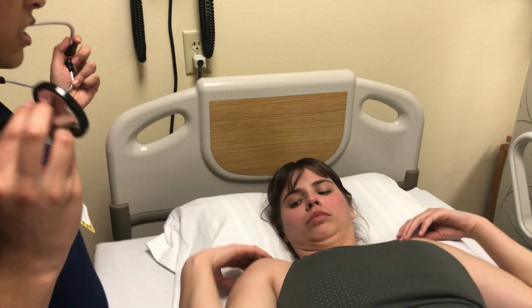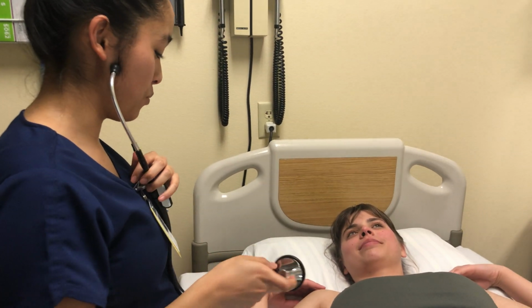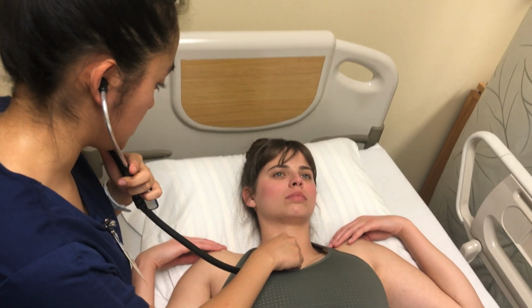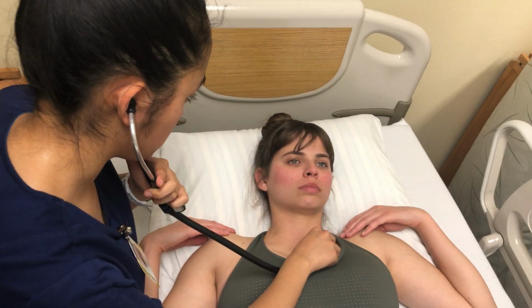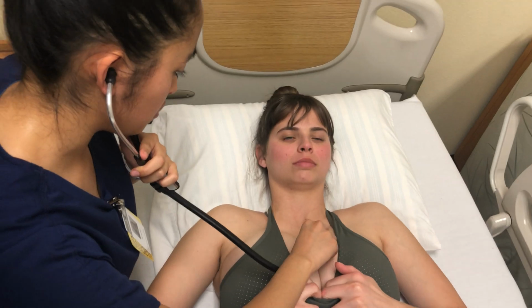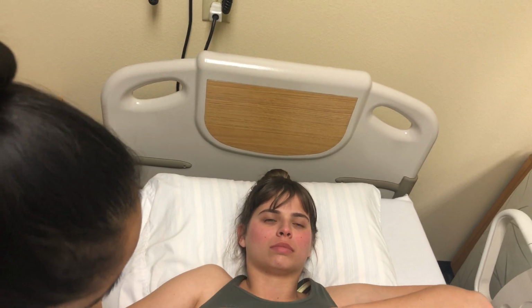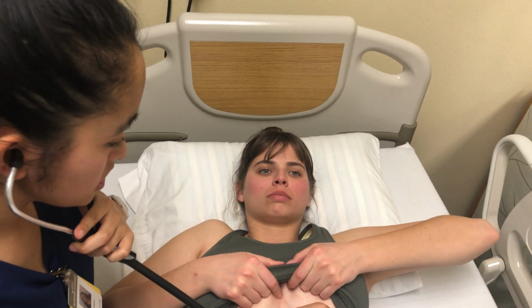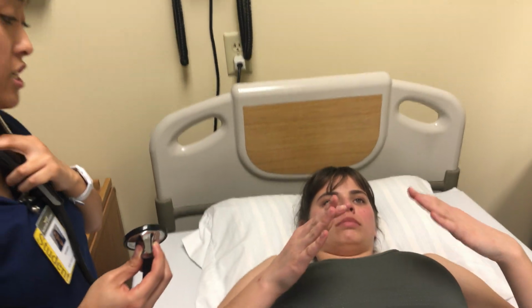All right, I'm going to go ahead and listen first with the diaphragm of my stethoscope, and we're just going to place it lightly on your skin, and that's the diaphragm for this cardio stethoscope, okay? And this is the second right intercostal space, it's aortic. Listen to my heart sound. And your second left intercostal space is your pulmonary. Your third intercostal space on the left side is your Erb's point. And your fourth intercostal space, that is your tricuspid. And fifth intercostal space, midclavicular line, mitral. All right. I heard good S1, S2 sounds.